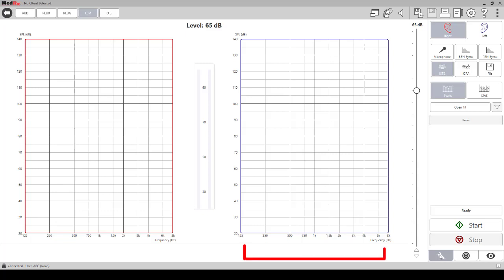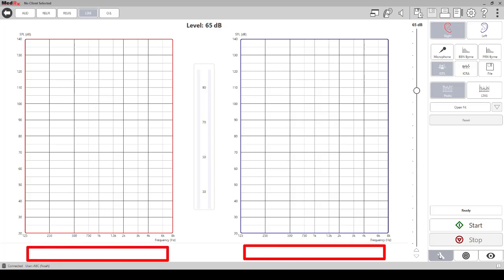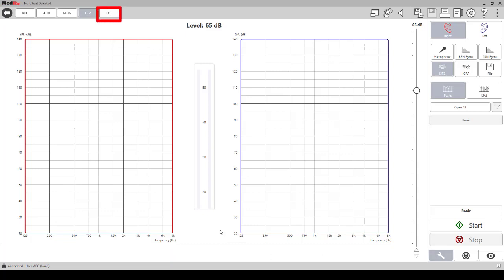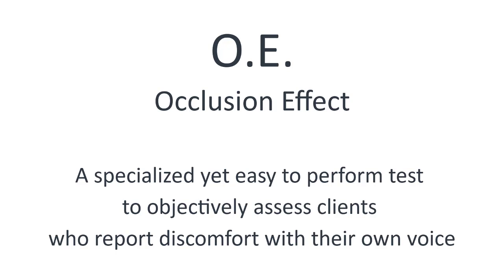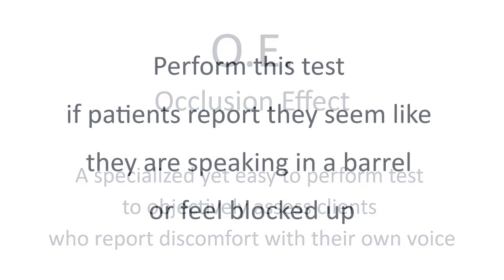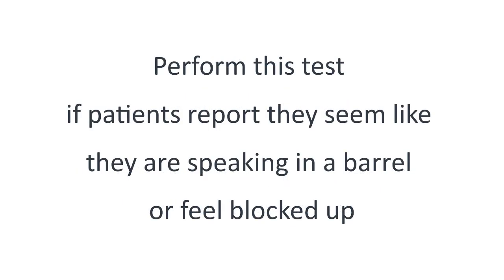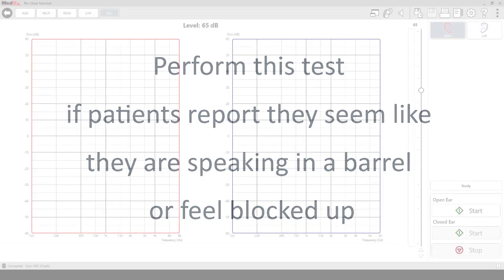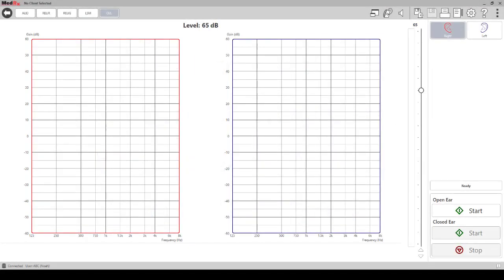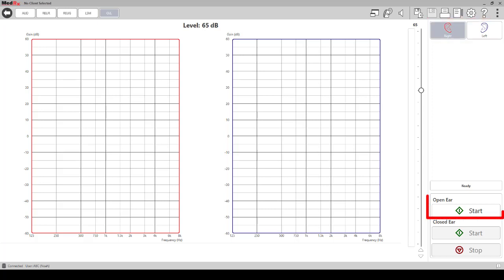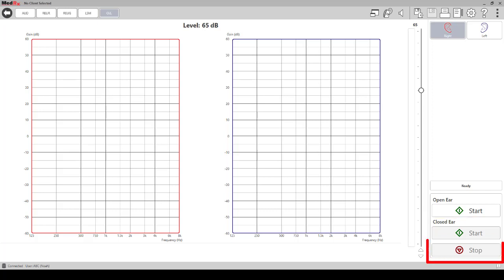OE - Occlusion Effect. The occlusion effect is a specialized yet easy to perform test to objectively assess clients who report discomfort with their own voice. Perform this test if patients report they seem like they are speaking in a barrel or feel blocked up. In the occlusion screen you will find right or left ear, the start option for performing the open ear measurement, the start option for performing the closed ear measurement, stop option if it is necessary to stop the closed ear measurement before completion of the measurement.